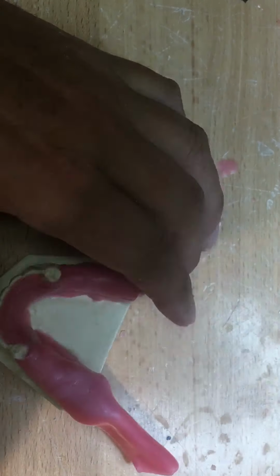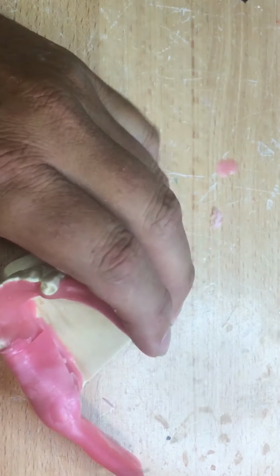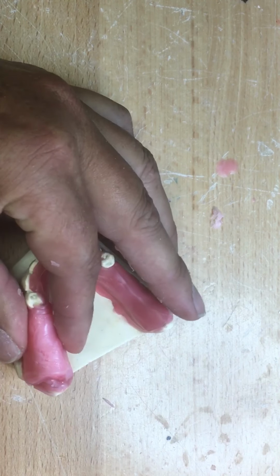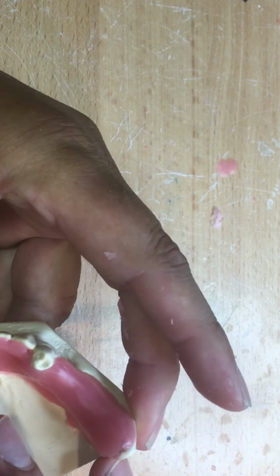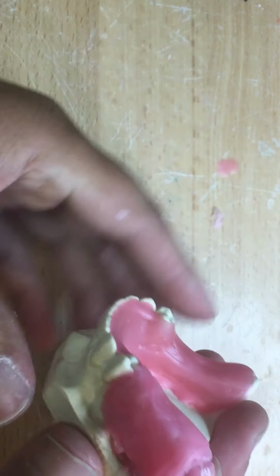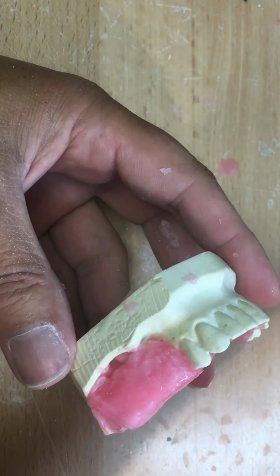Now, this is where most technicians will start to say, wow, this wax is soft. It's not like the wax I'm used to using. All the excuses come out right now. But you need to adapt to your situation. And I think that's the strength of the dental technician, to adapt to each situation. Each patient is different. Each treatment is slightly different.